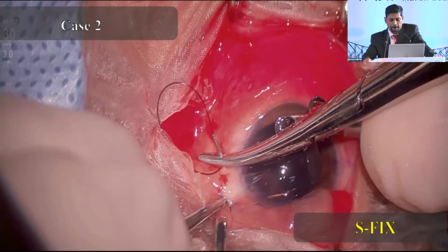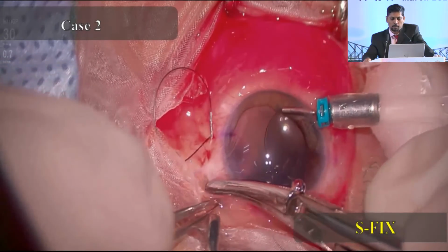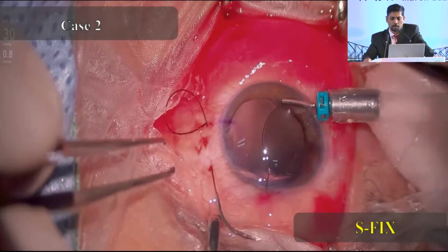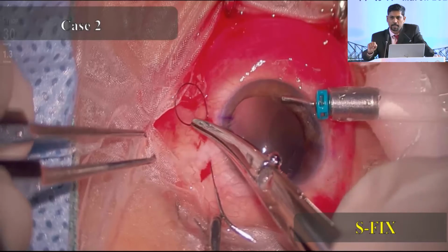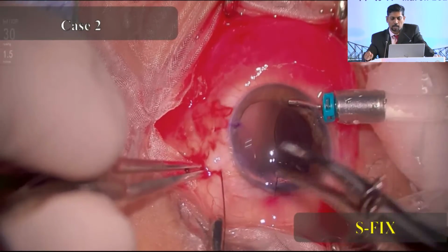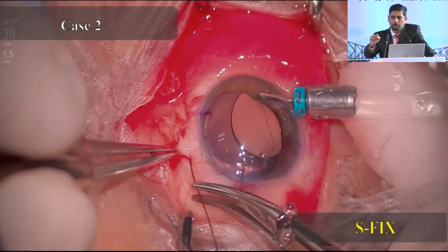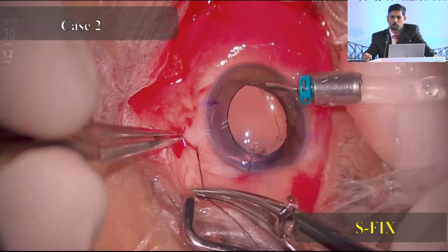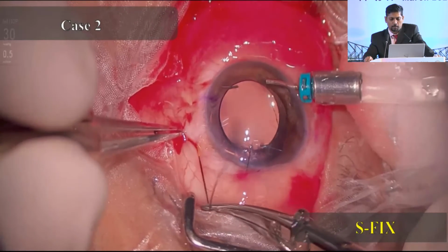Suture bite and retrieve. So remember, the suture bite has to start from the point of sclerotomy and traverse around 2 mm. It should be good. Don't take a long bite. That's when the haptic tip will get missed somewhere inside. Then you will find difficulties in centration. So I prefer to take a short bite, so that I would intentionally want the haptic tip to be seen outside the conjunctiva, and then at the end I can push it inside and tighten the IOL for good centration.